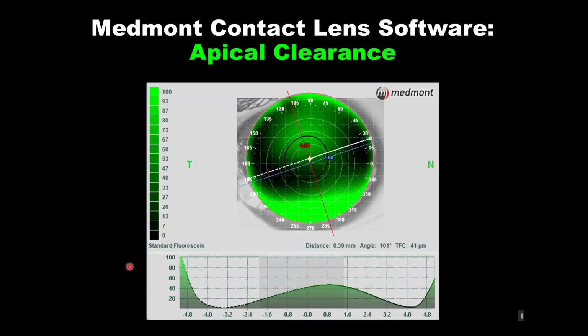So let's use the contact lens software. Let's find with this flat meridian, the white axis line, we'll take it around the clock until we find the point where the lens lands on two opposing sides so that we know our stability is created across that flat meridian.